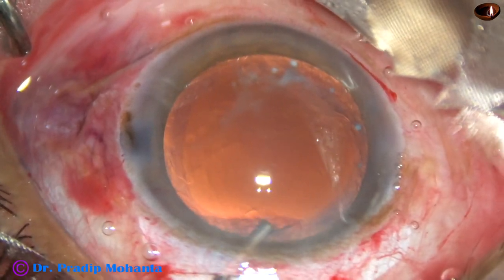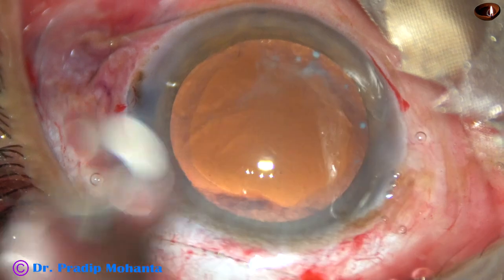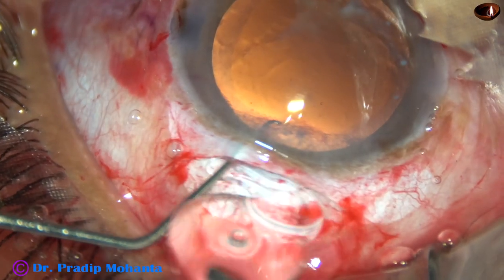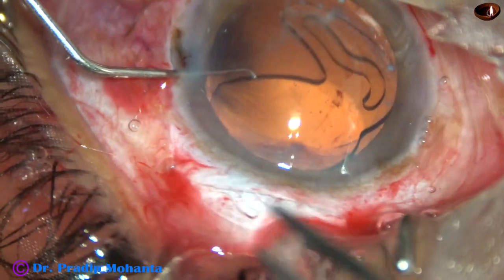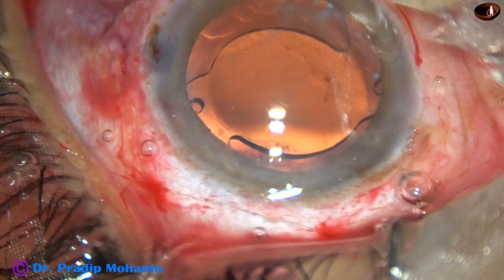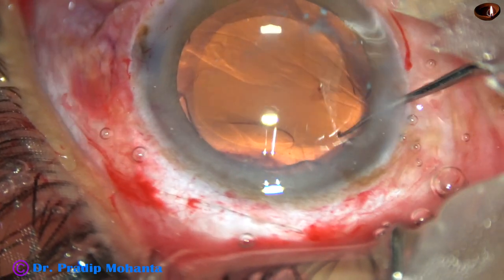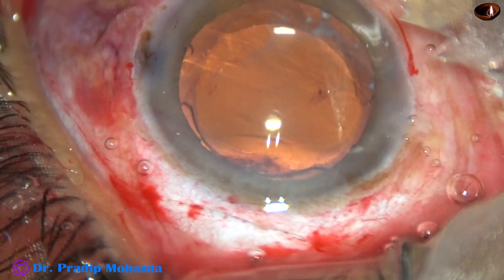Now I am going to implant an intraocular lens in this case. I am going to use a foldable intraocular lens because the rigid lens of appropriate diopter was not in stock. I depress the optic with the help of a Sinskey hook, the leading haptic goes into the capsular bag, then I go through the right side port and place the trailing haptic in the capsular bag. Yes — the lens is now nicely placed in the capsular bag.